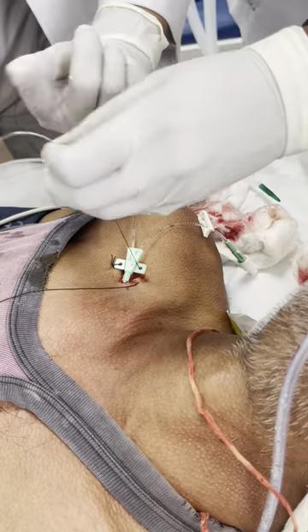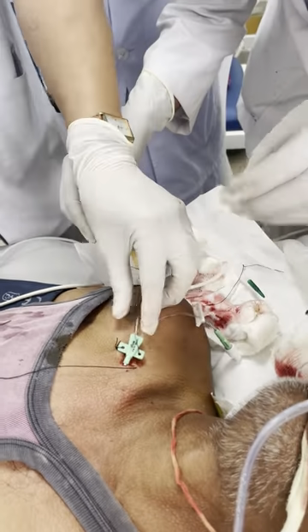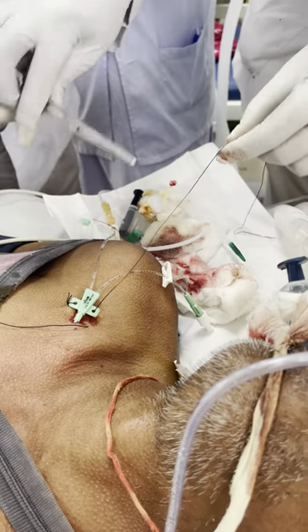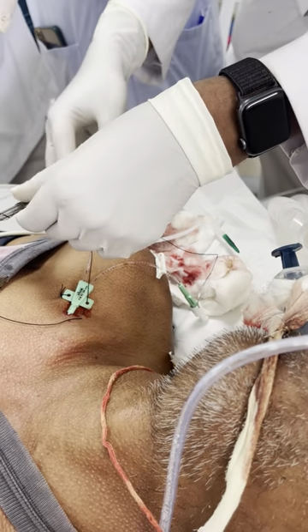One, two. If you want to avoid the what? Prick. Go like this. Take help of this as well. At least in first stitch. One, two, three. Good.